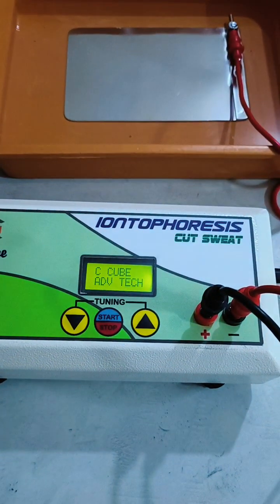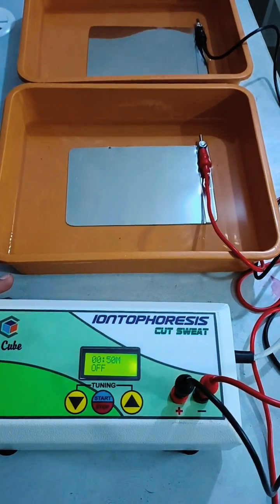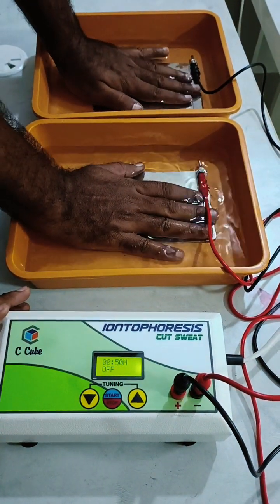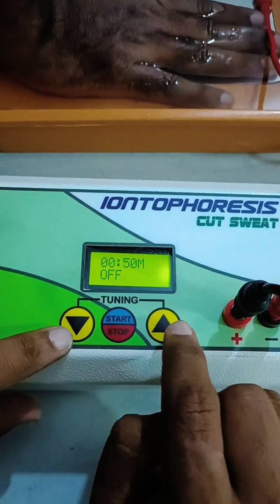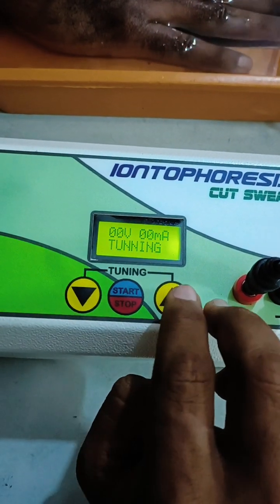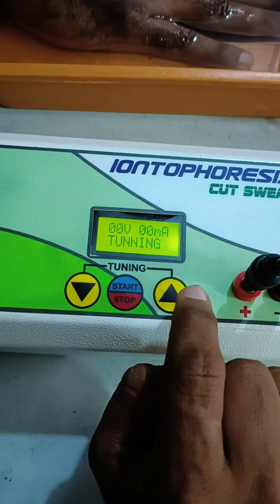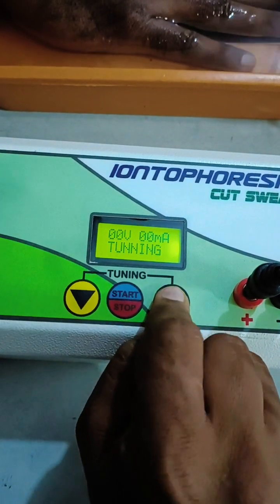For treatment, place your hand on the tray. For first-time users, a tuning process is required. Press the up and down buttons together to enter tuning mode. This is required to ensure that proper voltage and current are delivered to the user, as it varies from person to person. Now I will adjust the voltage and current levels.